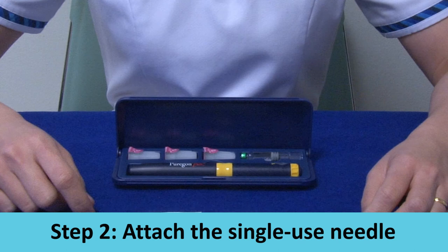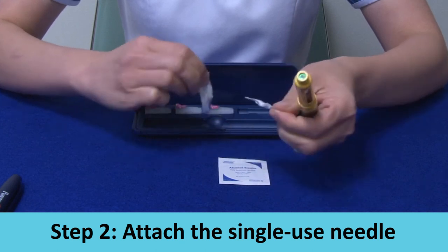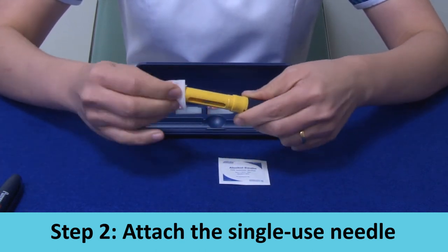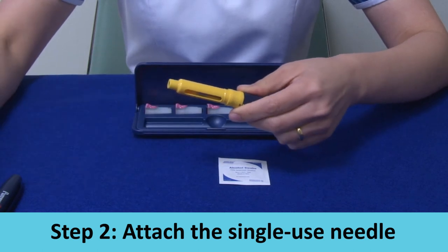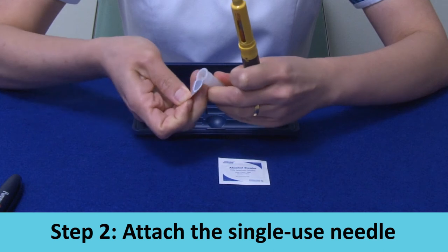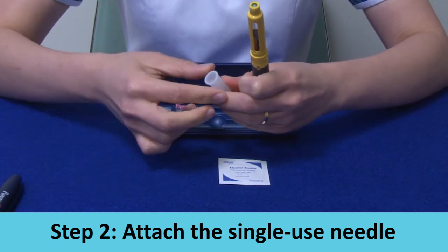Step 2: Attach the single-use needle. Clean the rubber inlay on the cartridge with an alcohol swab. Peel off the seal on the single-use needle and screw it tightly into the tip of the cartridge holder.